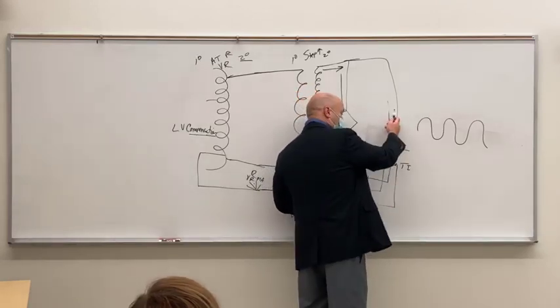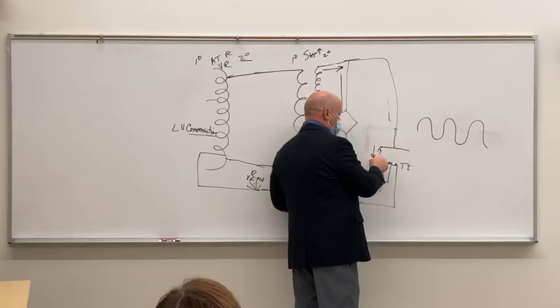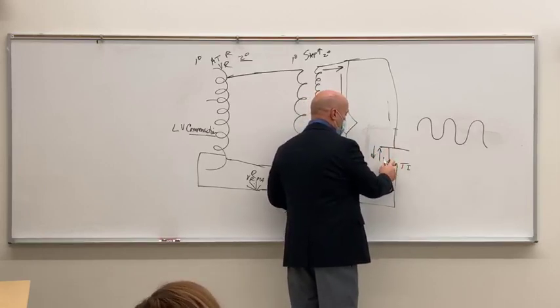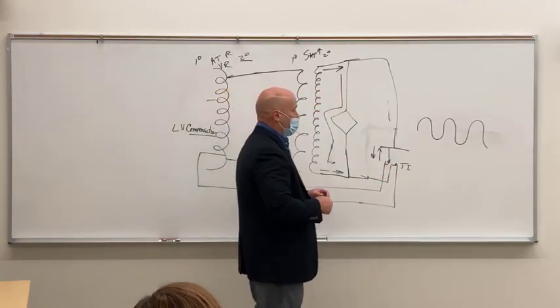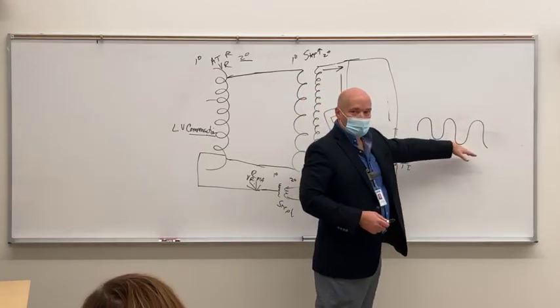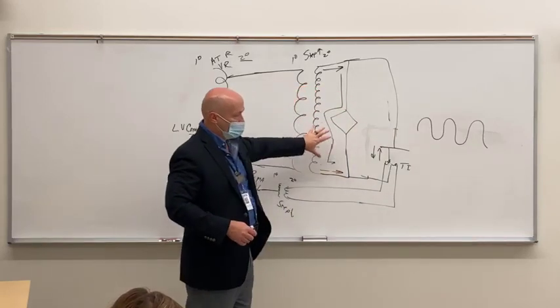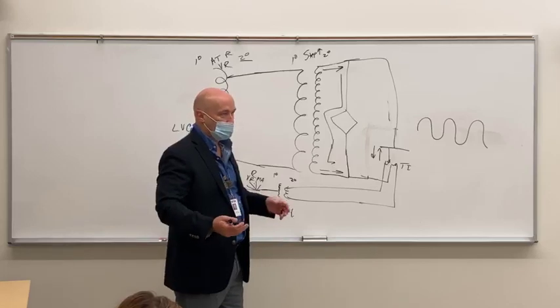Alternating current, when the current's going in that direction, we're good. But whenever the current tries to come back in this direction, if it actually does, then we can break our filament and it kills the tube right away. So the only time that you're going to have unrectified current would be either a total failure of your rectifier bank, or you're working with a dental unit.